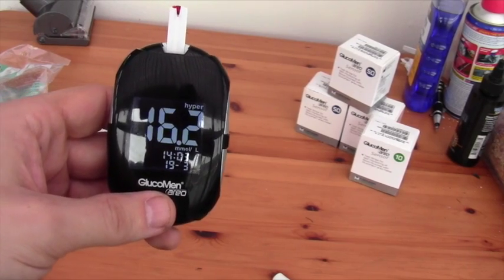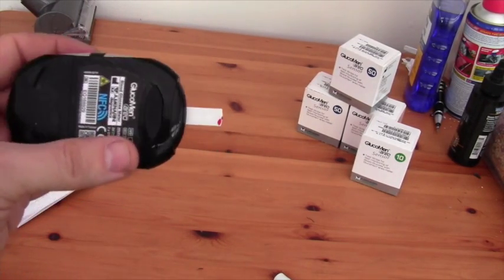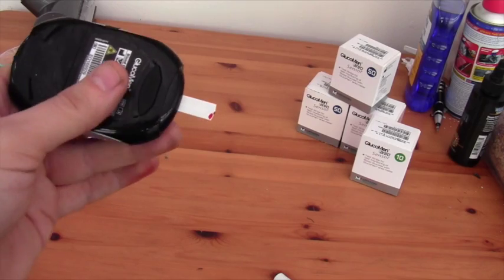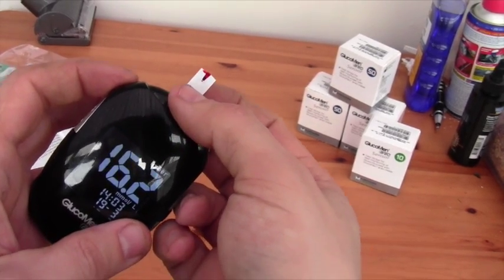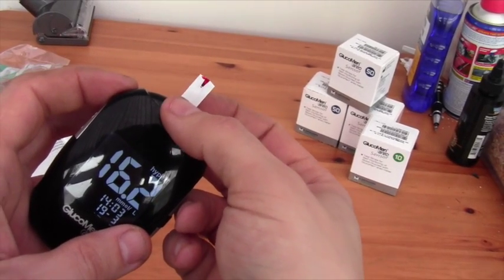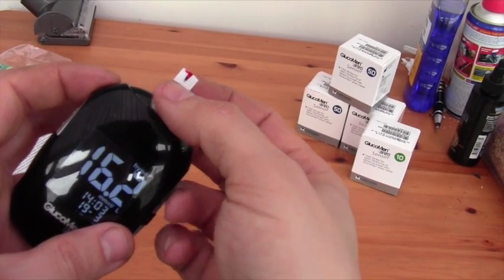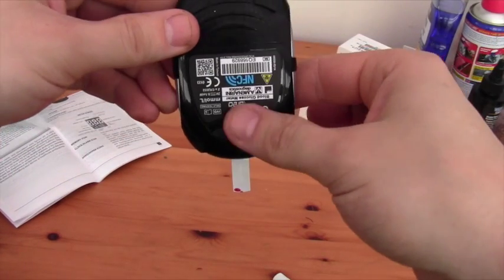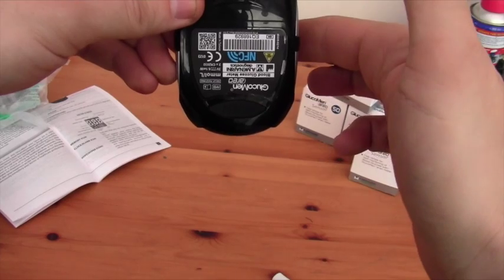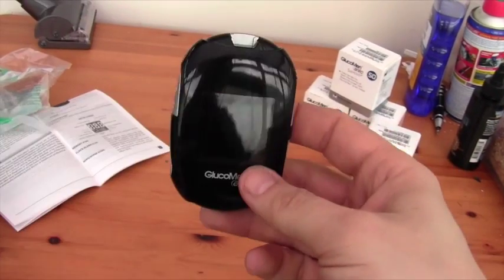One nice little thing is that if you don't want to risk getting blood on your fingers — there's enough space there to grab the strip without getting it — but if you've got really chunky fingers, this button on the back you can press and the strip will just drop out and the meter will turn off.